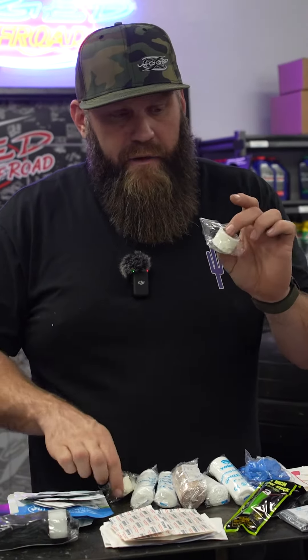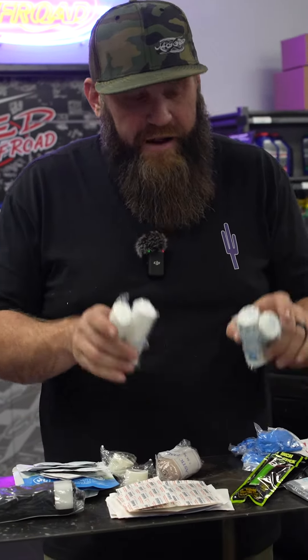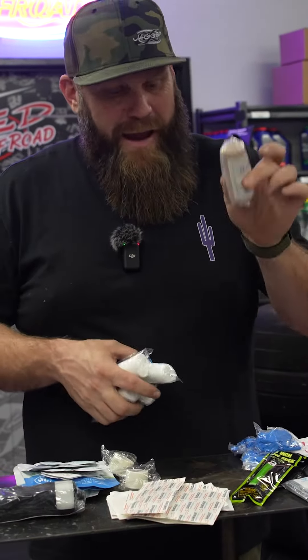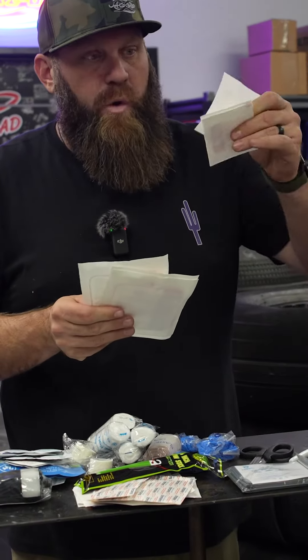We have tape rolls that go with the several gauze rolls it comes with. It also has an ace bandage, pairs of rubber gloves, a glow stick, scissors, and an emergency foil blanket. It already comes with a marker as well.